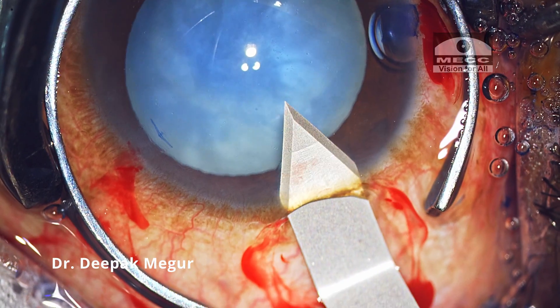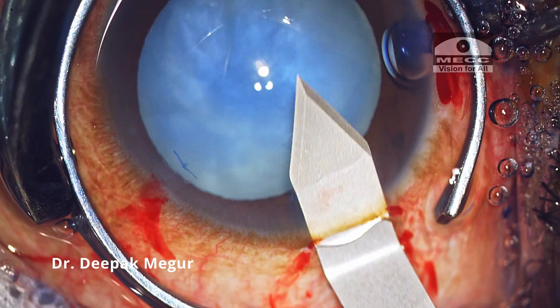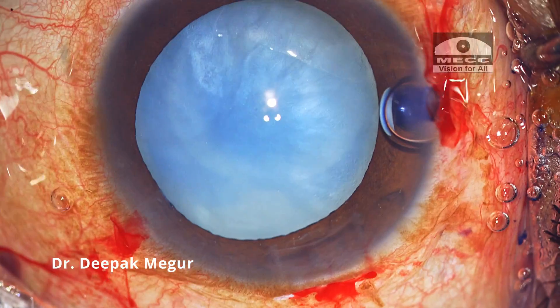My plan is to perform a two-stage rhexis, and I expect that decompressing the bag is going to be a challenge, which I'll be performing after the primary rhexis.